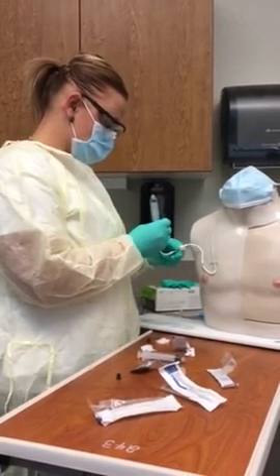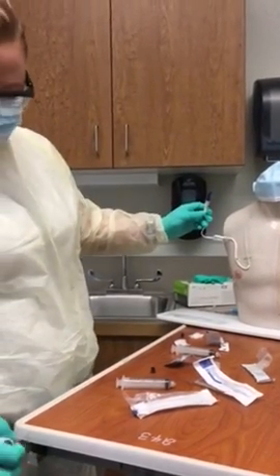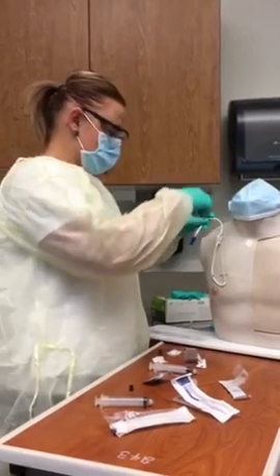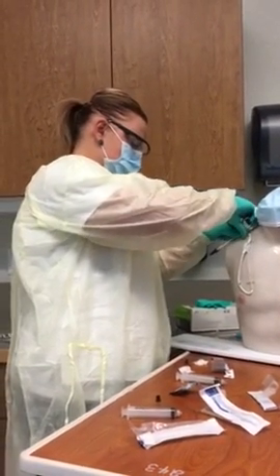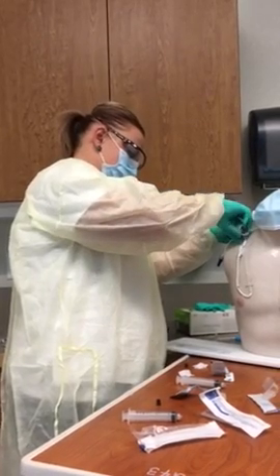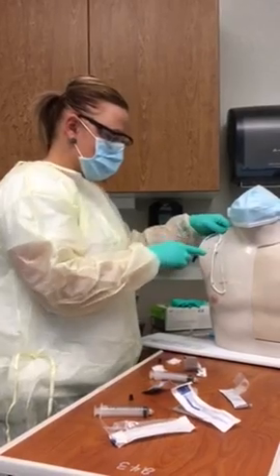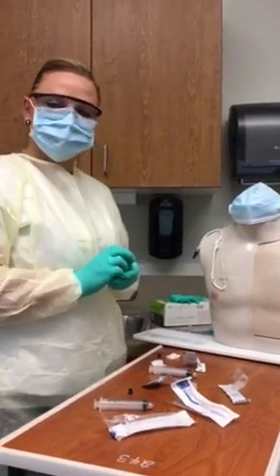I'm going to go ahead and clamp your line back off. And then I'm going to take my tape. And we're going to secure this back up here. So we don't want it to move at all. Oops. Alright, and then I'm going to go document. Thank you. Great, thank you.